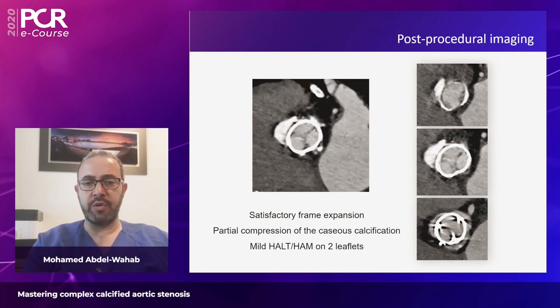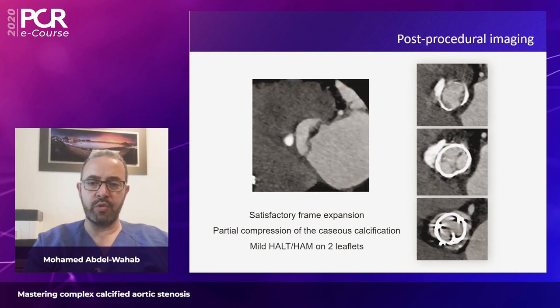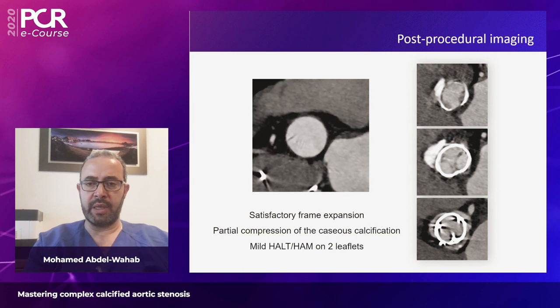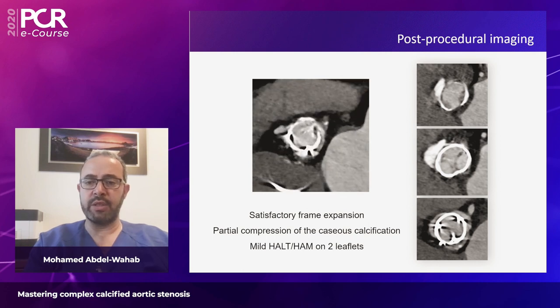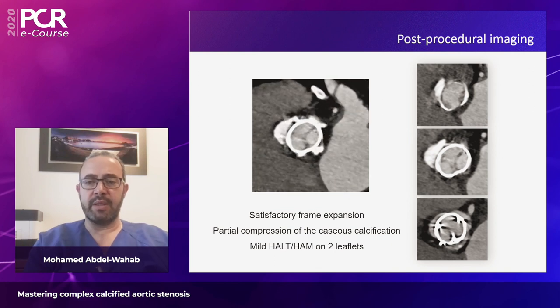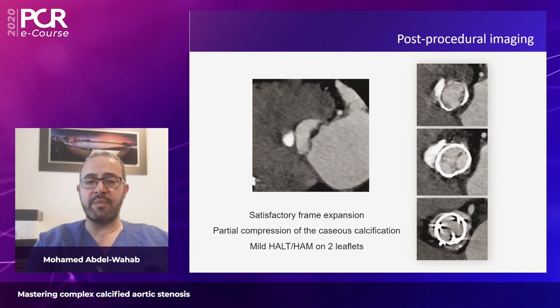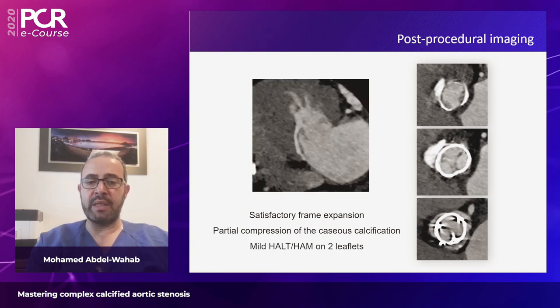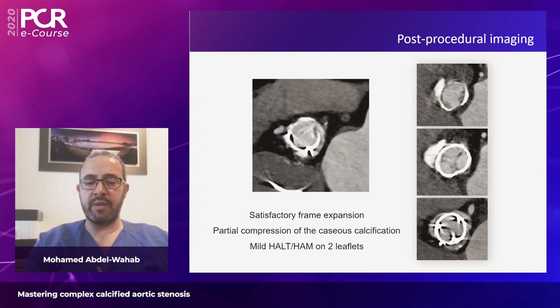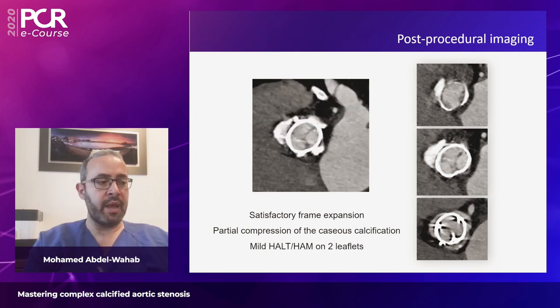We don't do this in every patient, but this is a very peculiar anatomy, and we wanted to demonstrate how the device interacted with the anatomy. You can see here the nice expansion, very symmetrical, maybe a little bit asymmetrical in the LVOT, but more or less complete expansion. You see that this caseous mass has been partially compressed, but it's still there. And you can see some mild hypoattenuated leaflet thickening with some effect on motion on two cusps.